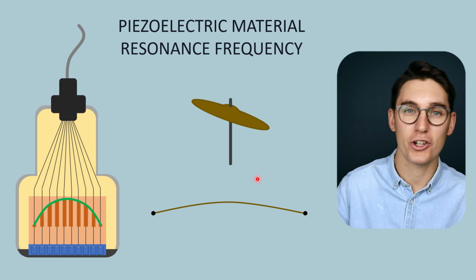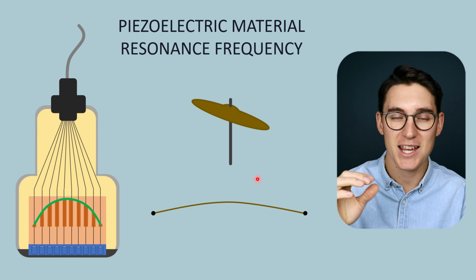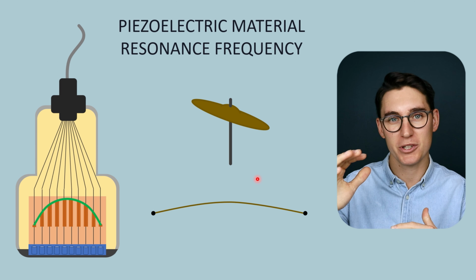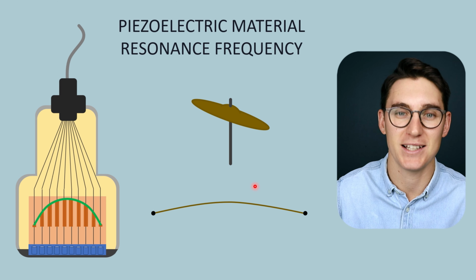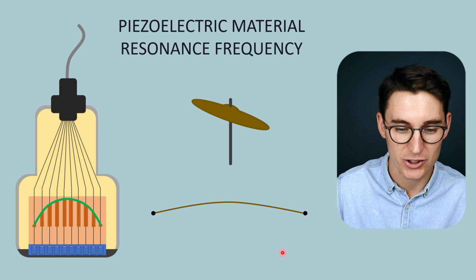No matter how hard you strum that guitar string, the same note will be played. The same frequency will come from strumming that guitar string. And both of these principles I'm going to use to describe various things that we see in the PZT layer. Now in this talk, we're going to think about the piezoelectric material as being a guitar string.